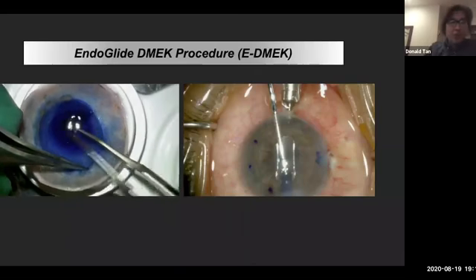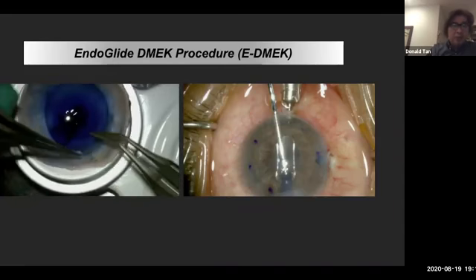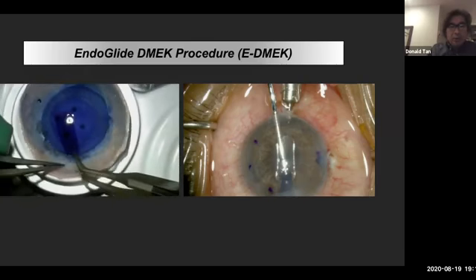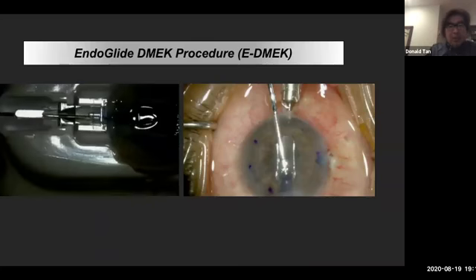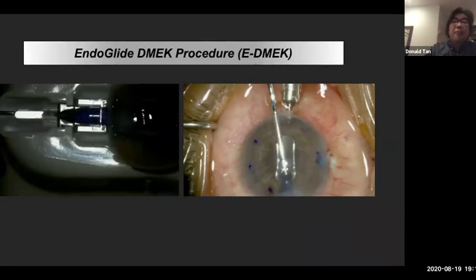So this is the procedure. After stripping the tissue, we carefully create a trifold. So this is endo in, we're folding the endothelium in into a coil, into a trifold. One area is a little bit, the advancing edge is slightly narrower, and basically we deliver the whole tissue to the endoglide device, and we're gripping the tissue, just pulling it straight in.